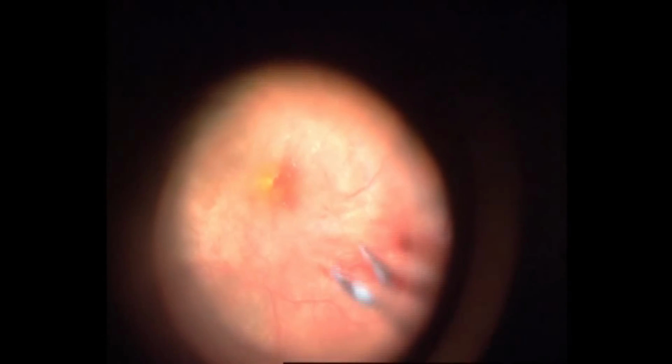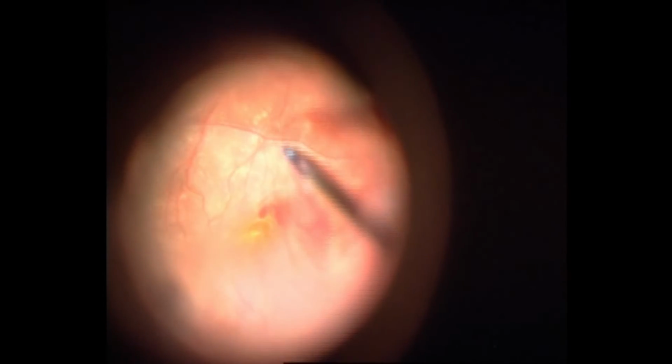Thus, PVD induction must be performed carefully, bearing in mind the various areas of normal and abnormal vitreoretinal adhesions. Adequate posterior vitreous detachment augurs an efficient and complete vitrectomy.